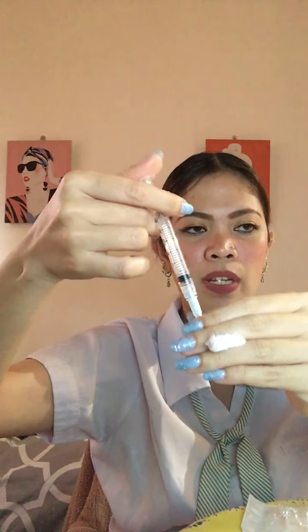Now release the skin, then grasp the lower end of the syringe with the non-dominant hand to ease the plunger.